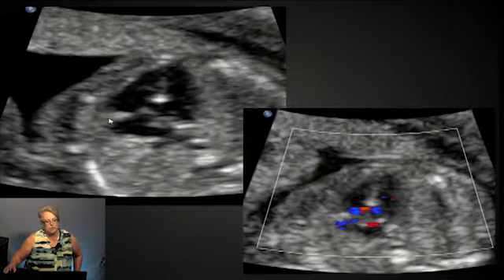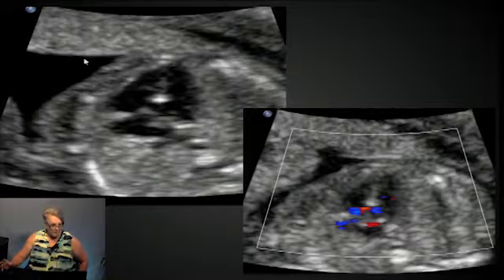So we see the spine here, always going back to where is the spine. That's why you need to keep the spine in view when you magnify or zoom up on the heart. Make sure that you keep the spine in that cross section of the chest.